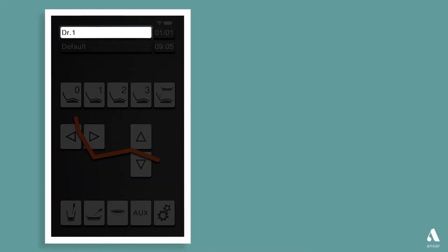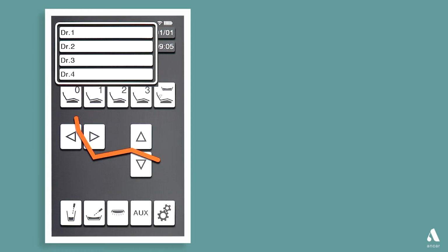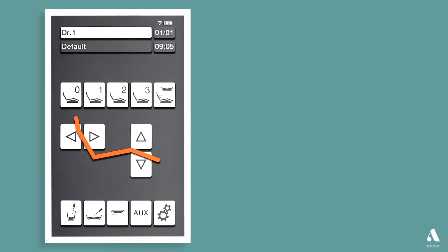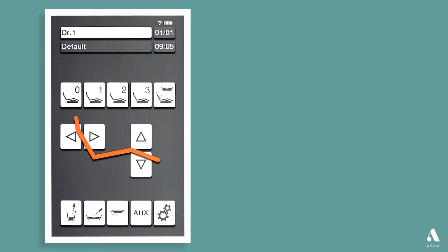The first field is the user profile. This is a selectable option, where the different work settings of the instruments will be saved for each of the profiles. The name of each profile is editable from the configuration screen. Along with the user profile, we have the name of the clinic, the date, and the time. This information will always be available at the top of the screen.